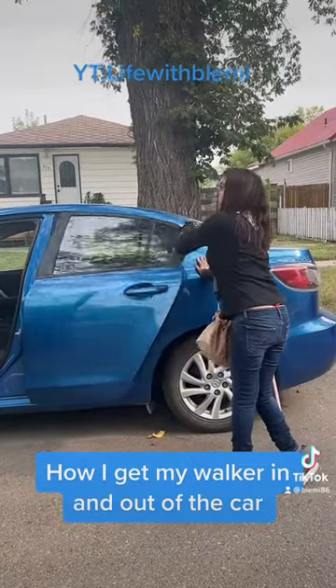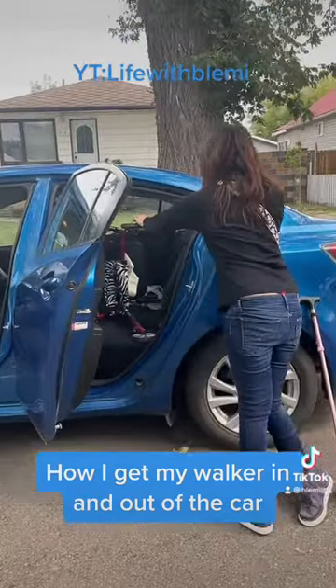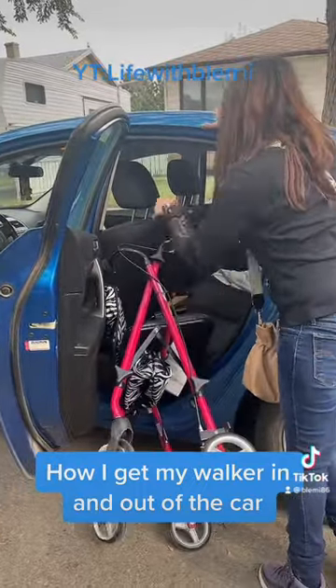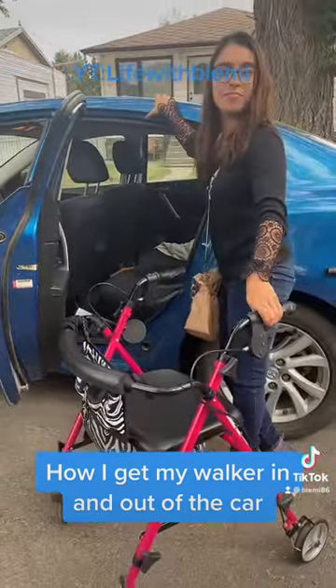I just open the back door, prop my cane up onto the car, and grab the walker and just pull it out of the car. And get it set up. And I'm ready to go — nothing to it.